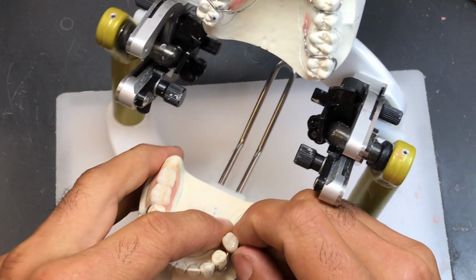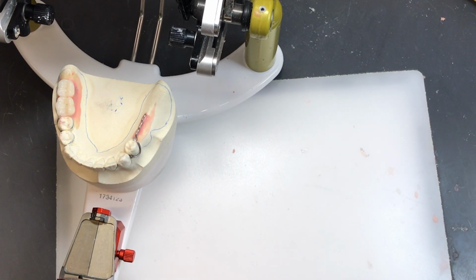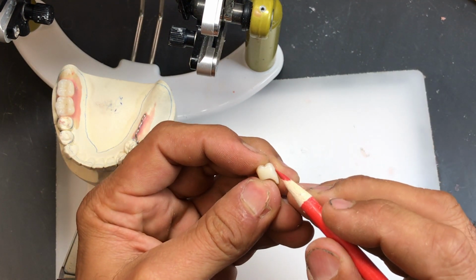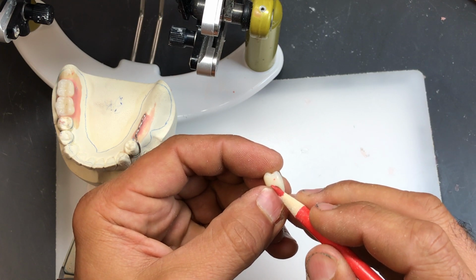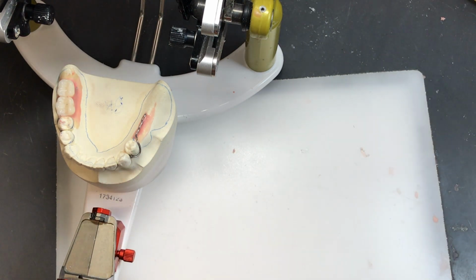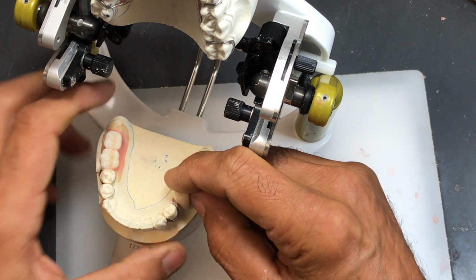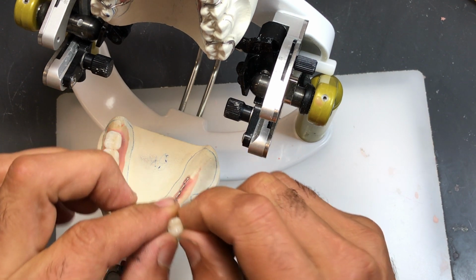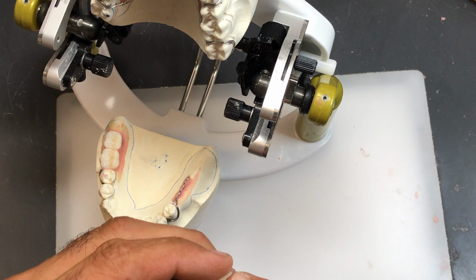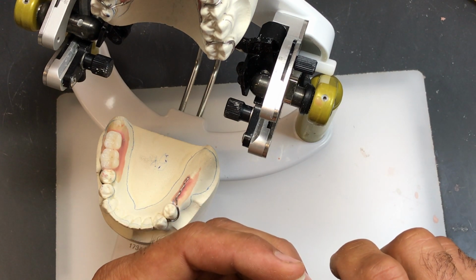As I'm looking at it from my angle, this way, I see that I need to reduce the tooth at an angle this way. Also, I need to reduce the ridge lap portion of the tooth, which is the underside of the tooth, to make it fit against the ridge. Maybe not so much. I'm going to leave that alone for now because I think I have some more room than I need between the model and the underside of the tooth. So I'm just going to start off by compensating for the wire.